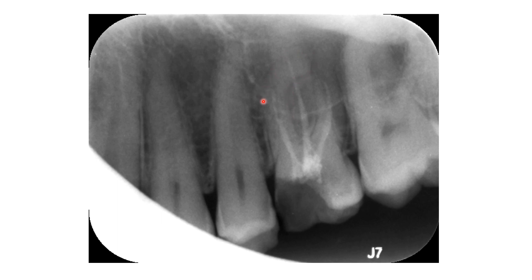This is the root configuration — this is the gutta-percha which is present here; it is actually underfilled. Now for the distobuccal root, don't start at the apex — you will be misled. Go from the alveolar crest upwards, upwards, upwards. This is the root — can you see it over here? This is the root of the tooth, or the apex.